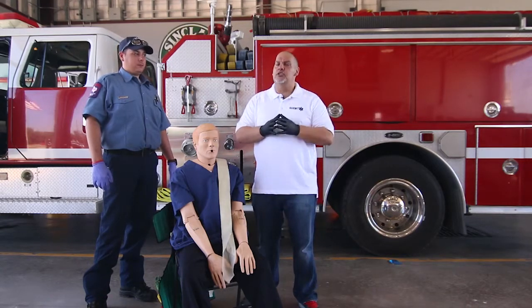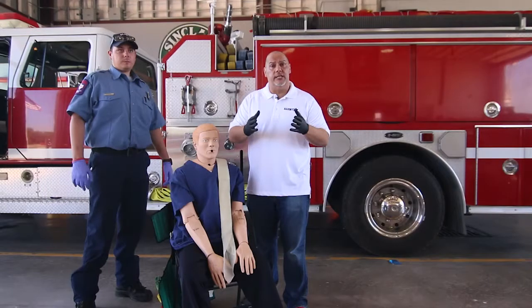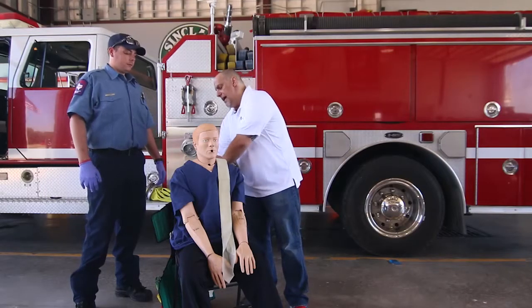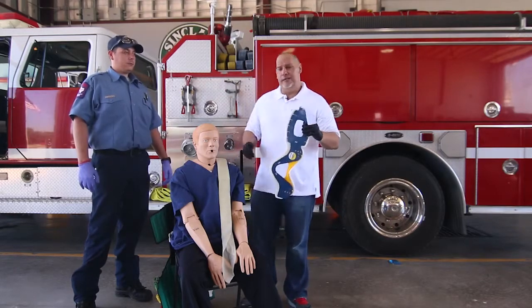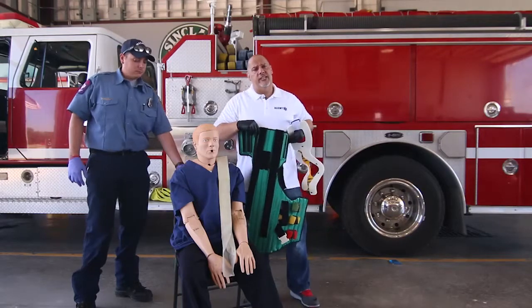In the future, these are skills that you may not be using as much as we used to in the past. The things that we need to have for this skill station: we need to have a cervical collar, and we'll need to have a KED, which is the Kendrick's Extrication Device.